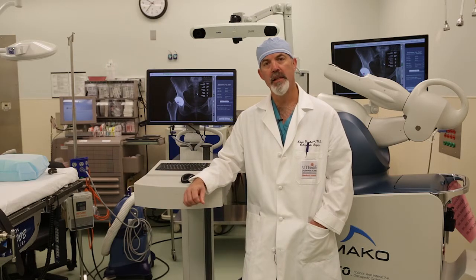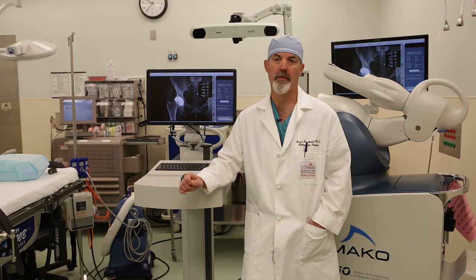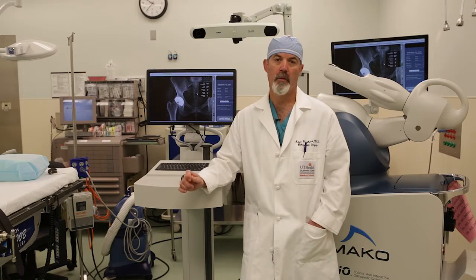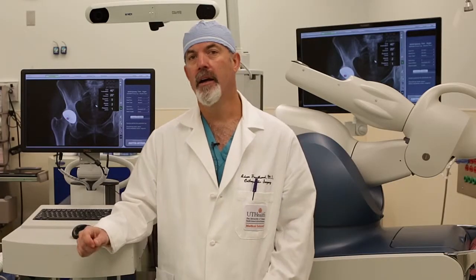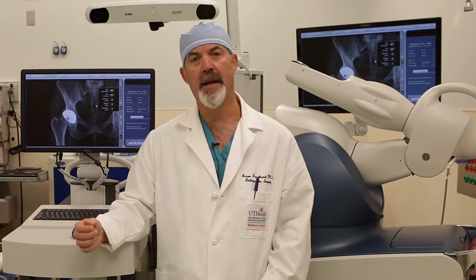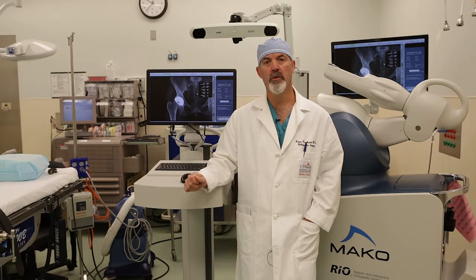With respect to hip replacement, we can get leg lengths and offsets very accurately intraoperatively, and we can make adjustments so that we're putting a patient's hip back where it belongs. The theoretical benefit of these things is if you reproduce the patient's anatomy in a way that's more accurate, we would anticipate that the outcomes should be better. Safety-wise, this is an incredible tool in that what you plan is what you get.